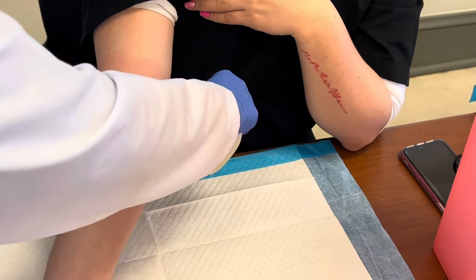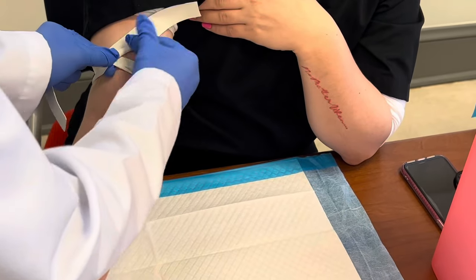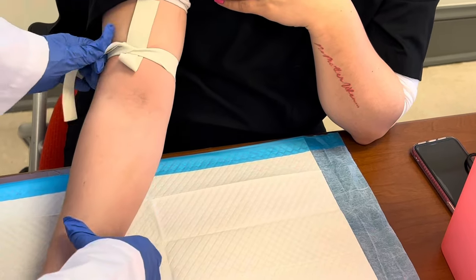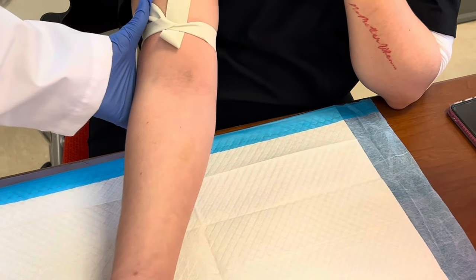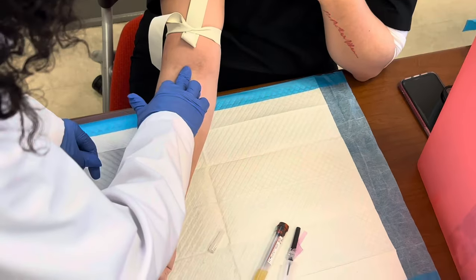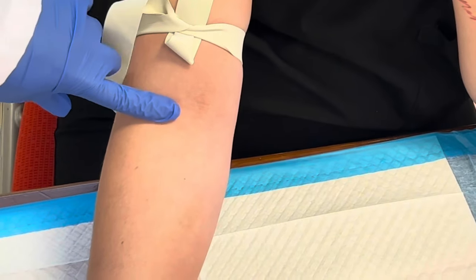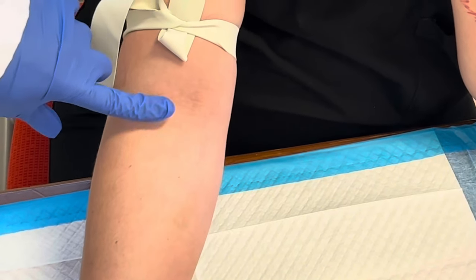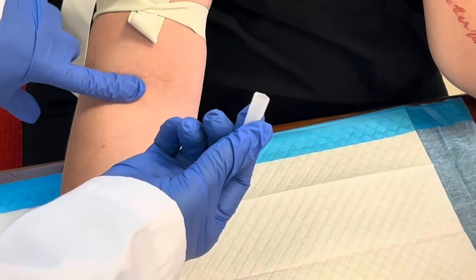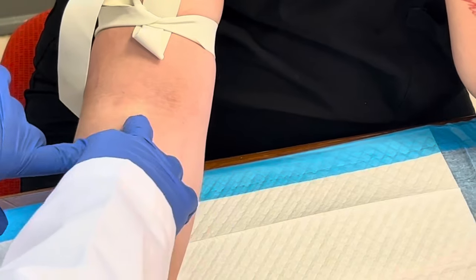Longer than a minute had passed, so I took the tourniquet off and I'm going to reapply it to show you guys another method. I actually got this method from the YouTube channel Phlebotomy Solutions, so shout out to them. I'm going to have her again make a fist. I feel her vein right there in the middle. This method uses the cap to your needle — remember we had to move this cap to assemble our needle. I feel her vein right there and I'm going to go right here.